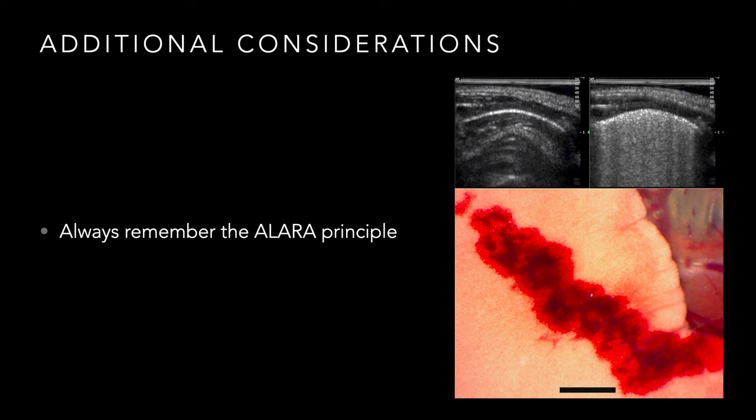Most of the time, who really cares? If you're scanning a muscle and you put a little energy into that muscle, whoop-de-doo, it's not going to do a ton to the muscle. But certain structures are sensitive. I mentioned eyeballs and babies because those are two sensitive structures, and you need to be a little more careful because putting energy into them can have effects, particularly mechanical effects and thermal effects.